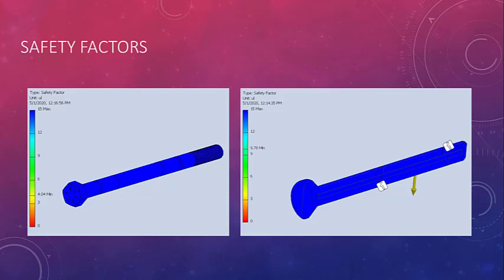As we know, if the factor of safety is below 1, then that means that the part will bend out of shape and will not return to that shape. Fortunately, both of my parts came out above 1, making them able to withstand the loads put on them without bending out of shape permanently.